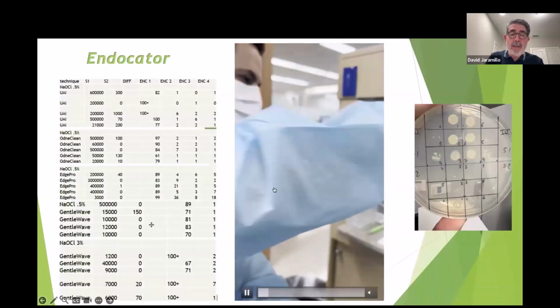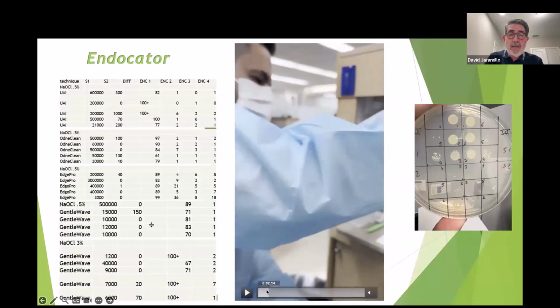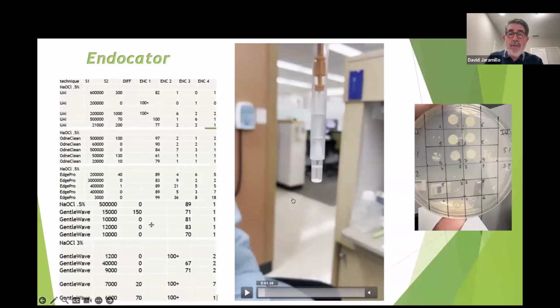So this is the device. The device has this plastic tube with a solution and a powder, and this swab. So whatever is inside the root canal, after we clean and shape, we disinfect and we did the ultrasonication and all that, we inactivated the sodium hypochlorite with sodium thiosulfate. Then we irrigated with water, and we suck out that water.